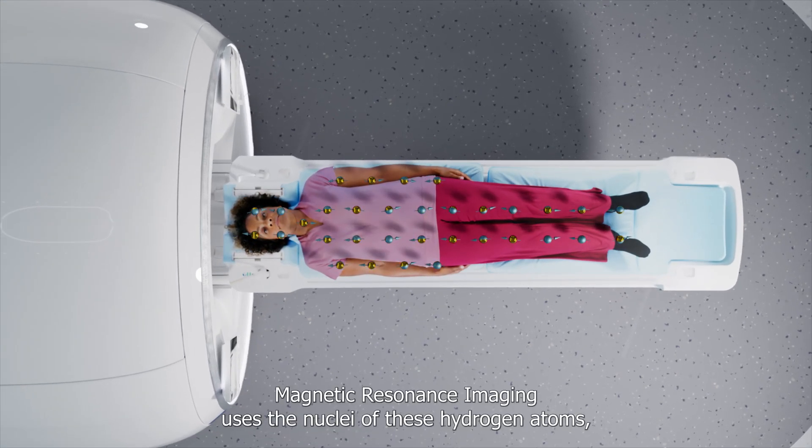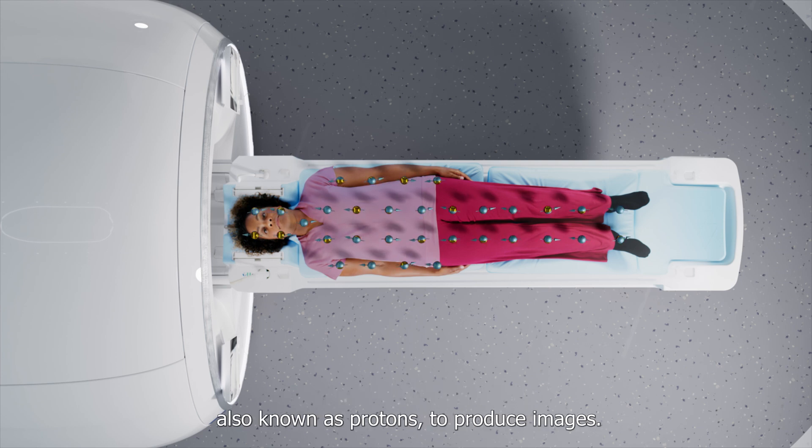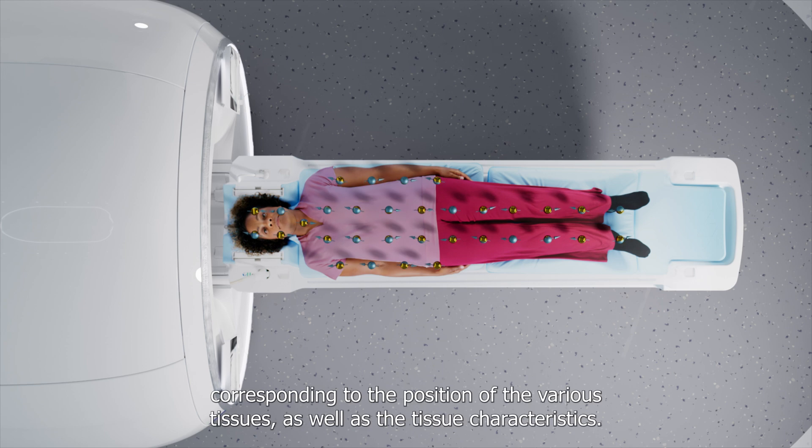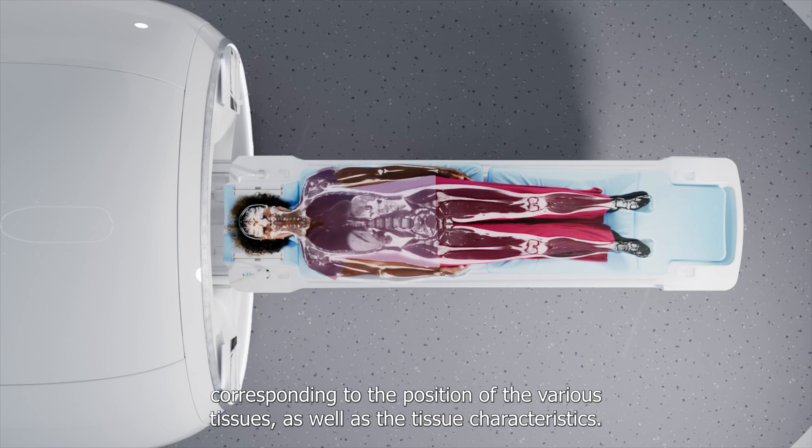Magnetic resonance imaging uses the nuclei of these hydrogen atoms, also known as protons, to produce images. MRI can be used to show the position and concentration of protons in the body, corresponding to the position of various tissues as well as their characteristics.